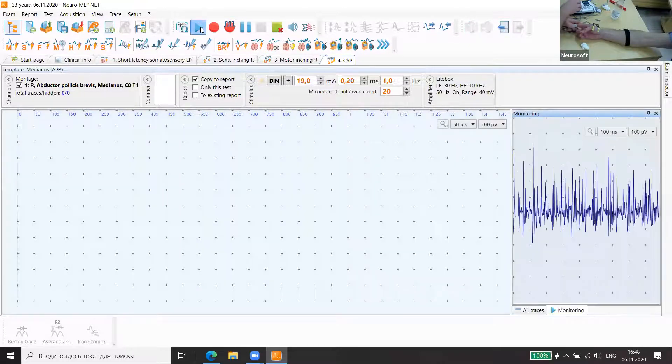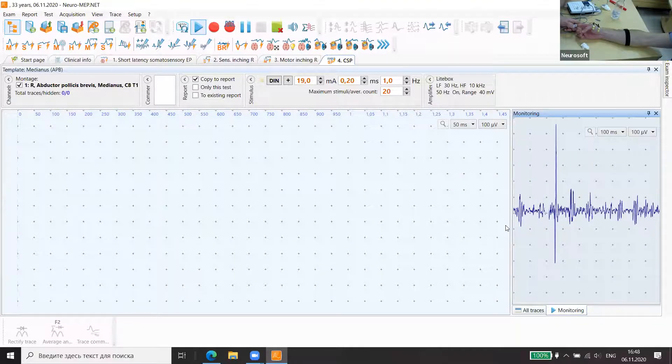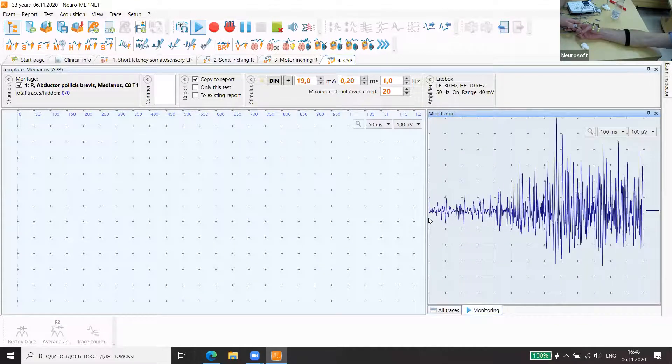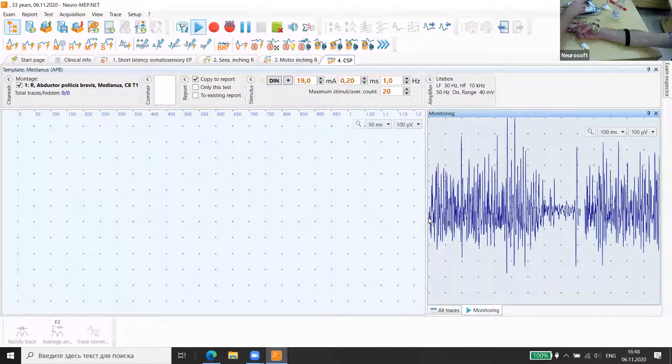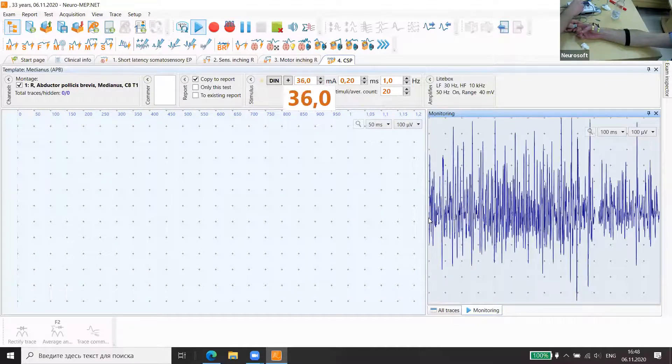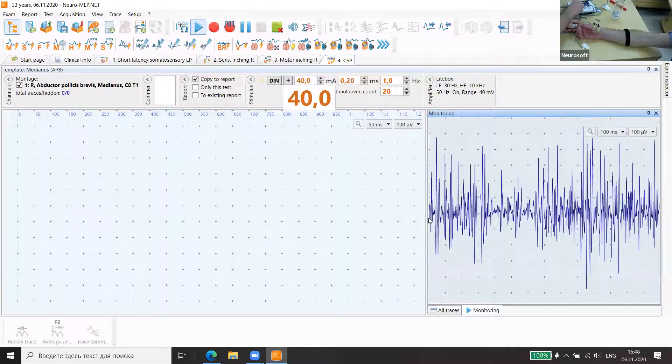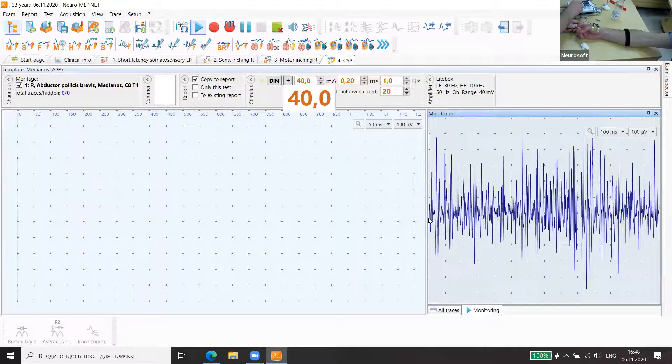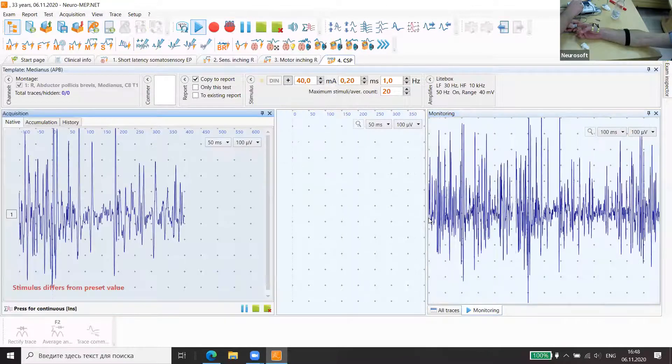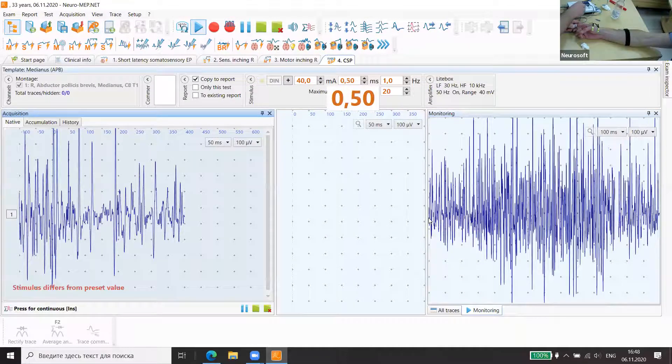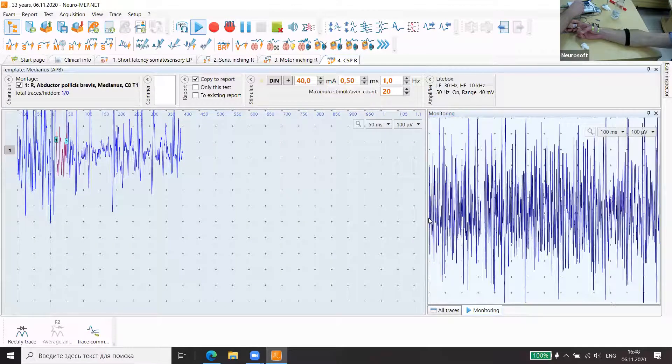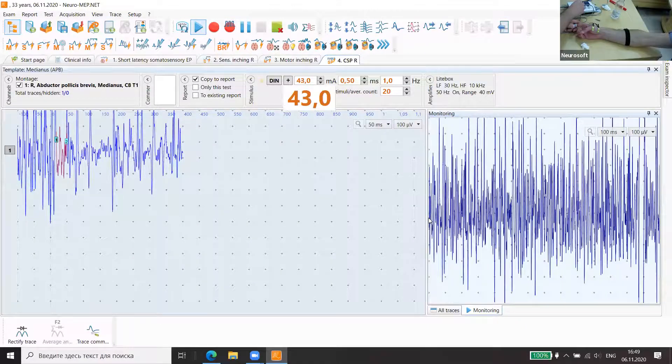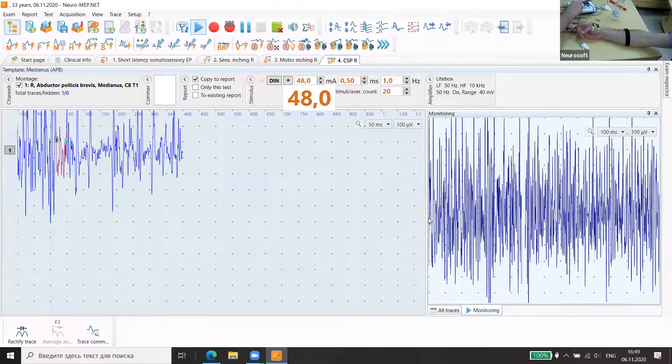You can see monitoring. It's the tension of the muscle. We stimulated. We started with about 40 milliamps. We increase.